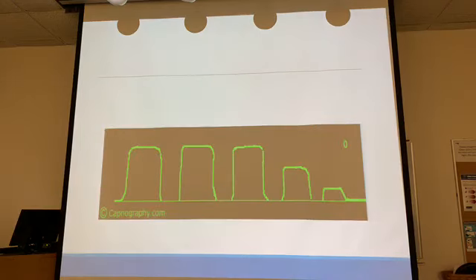Okay? That is what you will see when you intubate the esophagus. You'll have a flat line, with these little bitty squiggles, but you're not going to have a value and you're not going to have a waveform. You better pull that tube, or you better make sure the patient has a pulse if you know the tube is in the right place. Okay? What's this one? That's the esophageal tube, right?